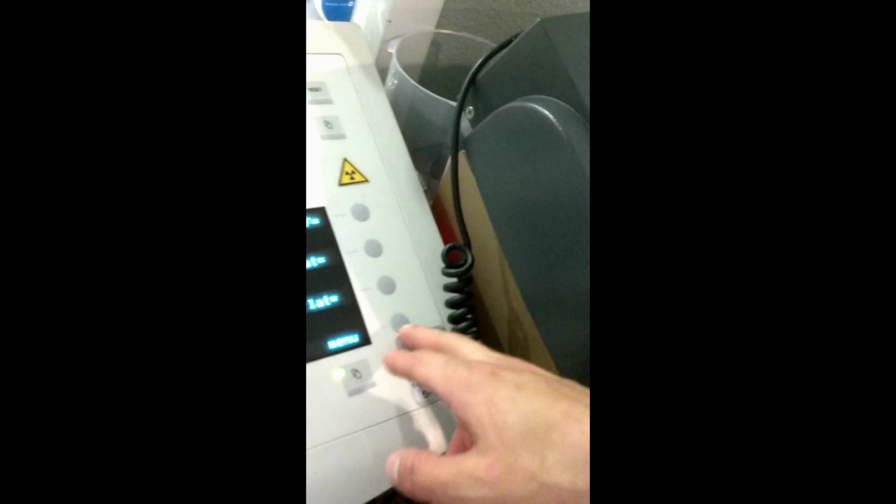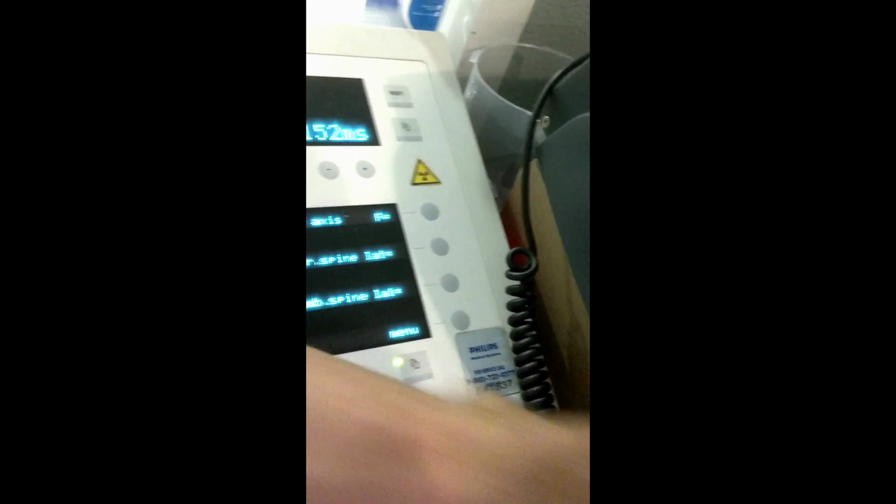We'll come over here now to the console where I'll be setting up for the technique, and this will all be in the bucky. Shoulder AP, and I will shoot it at 70 and 20. That looks good right there. We'll go ahead and shoot it at 70 and 20 in the bucky for all three views.